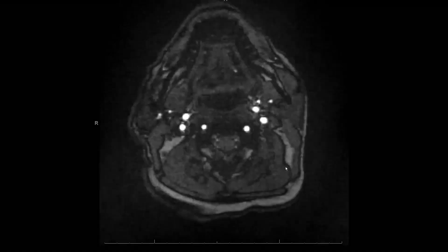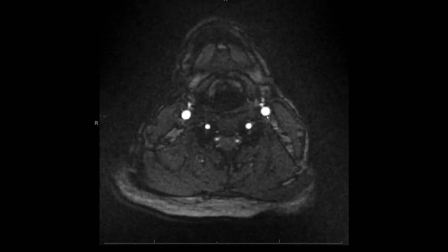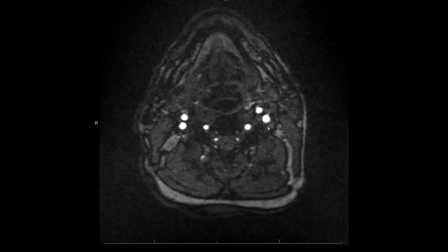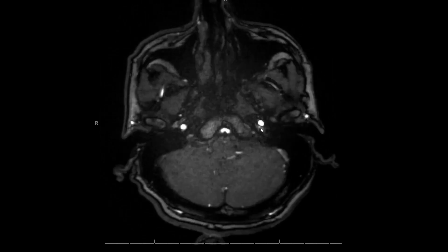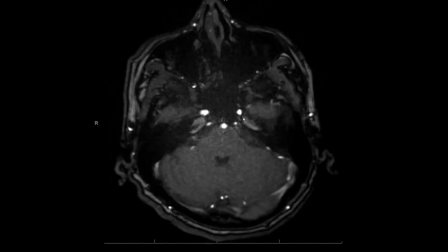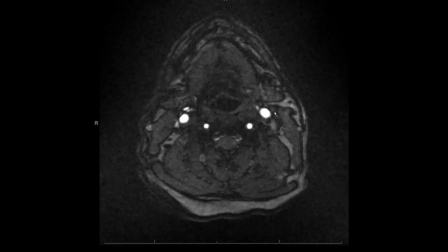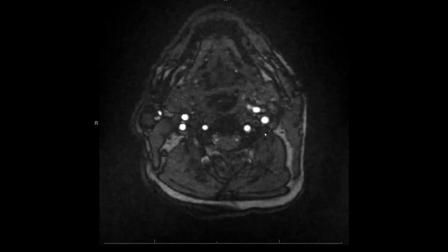Once I'm happy with that, I'll come back down to the beginning of my study and follow the same pattern for the left internal carotid artery. You have the common carotid artery before the bifurcation — track it as you go up, looking for any areas of narrowing or significant atherosclerotic plaques. We have the carotid bifurcation here, with the external carotid and the internal carotid posteriorly. The internal carotid comes up and goes into the skull base in the petrous canal, becoming the intracranial ICA. I don't personally spend a lot of time on the external carotid branches, but do glance at them to make sure there's a normal branching pattern and no abnormal areas of filling.